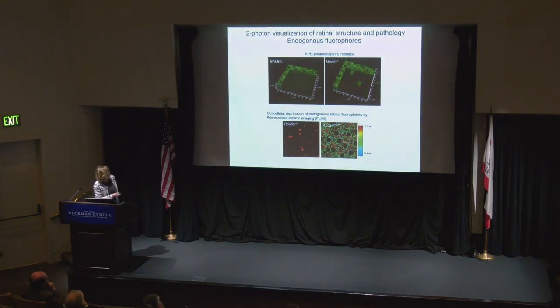However, in the other model, the MERTK knockout mouse that has defective phagocytosis, already immediately under the RPE you can see the defective photoreceptors; they are enlarged. And if we go a little bit deeper, towards the inner retina, we can see a multitude of macrophages.